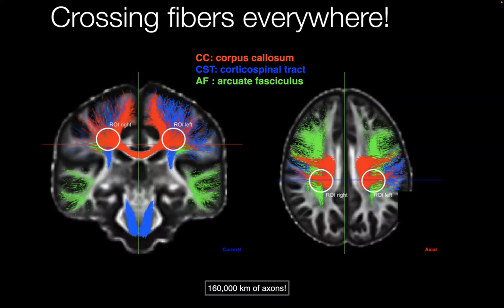And at the time when people couldn't do good tractography, I remember there's a paper where people started manually adding connections that we knew existed from anatomy, right? So they took the connectivity matrix and they said, what? Tractography doesn't give me these connections? I know these two parts of the brain are connected. Why are they not connected in my matrix? Well, let's put a 1 there. And let's put a 1 there. 1, 1, 1. And suddenly, ooh, it explains the data much better than if the connections are not there.